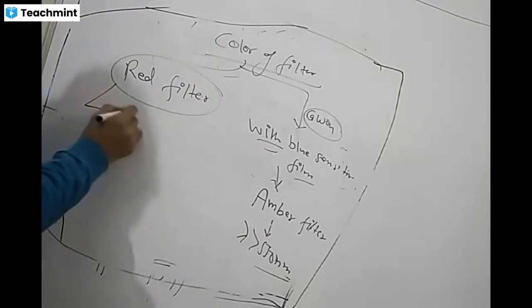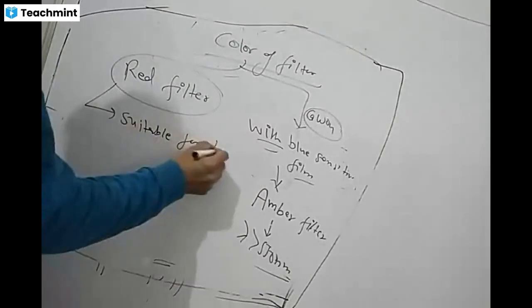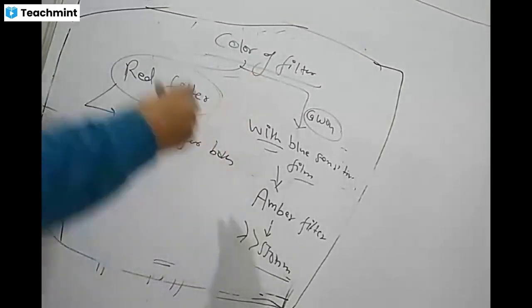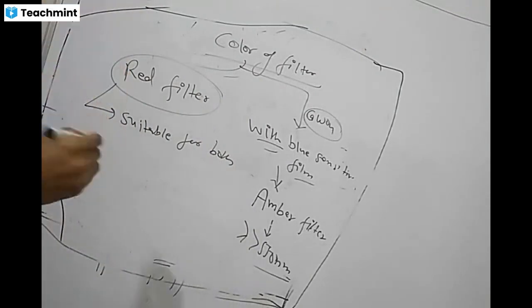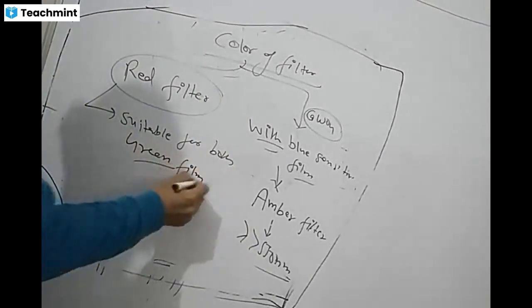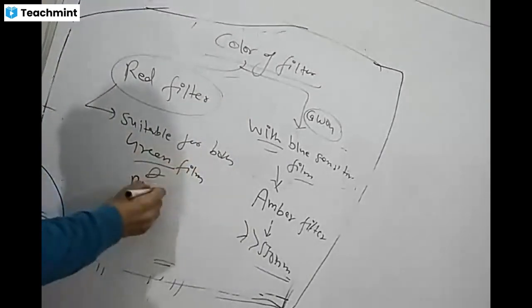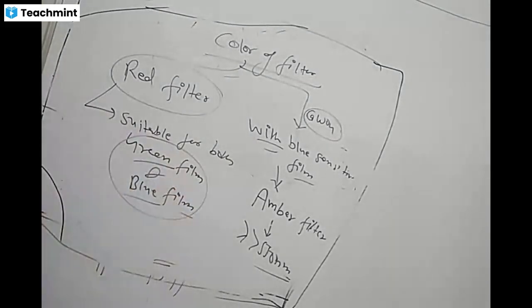Whether you are using your calcium tungstate screen or your rare earth metal screen, it is suitable for both green film and blue film. So with both you can use red.